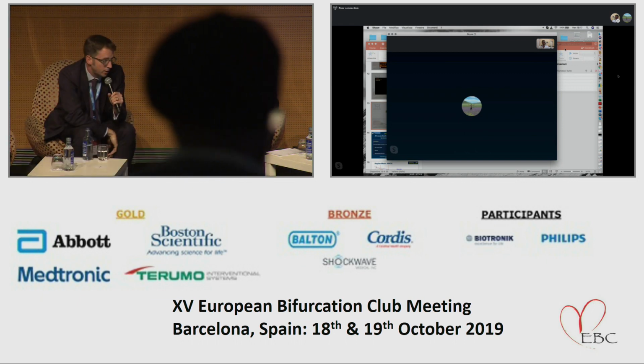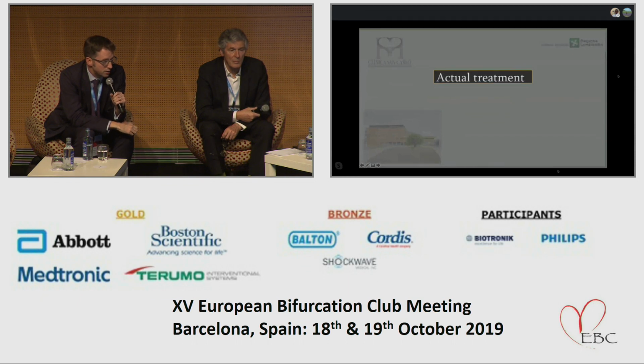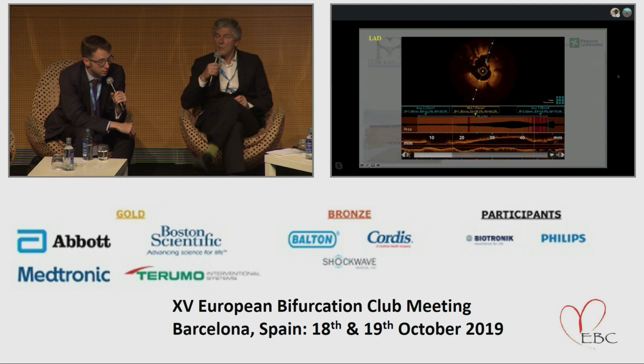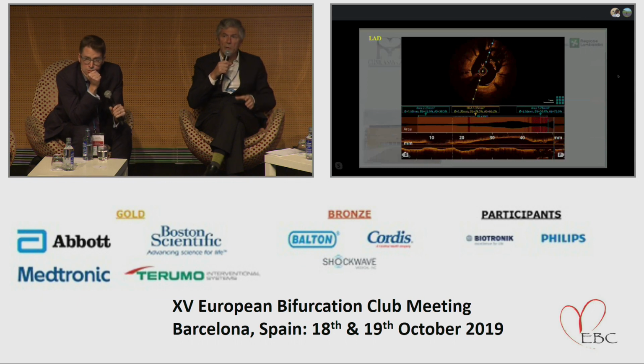Yeah. And then maybe that final OCT image, because again, the most striking element for me of your final OCT is the very diffuse in-stent restenosis within the LAD that you're left with now. It's going to be a challenging procedure. So that MLA graphic in the middle of the screen shows very significant luminal compression throughout the whole length of the LAD. So do we have comments in the room?